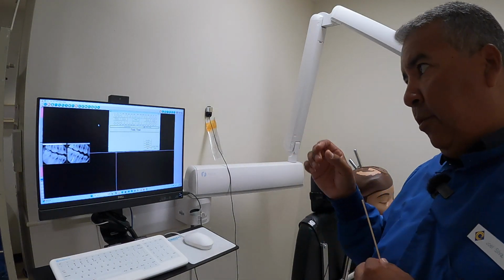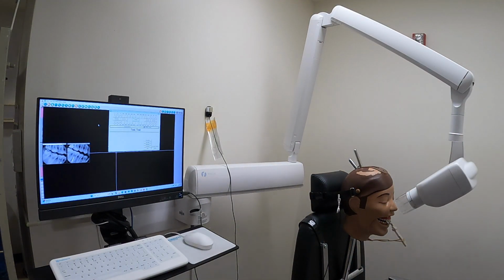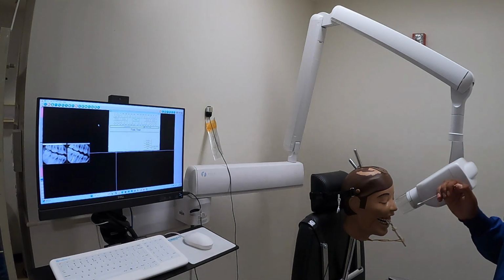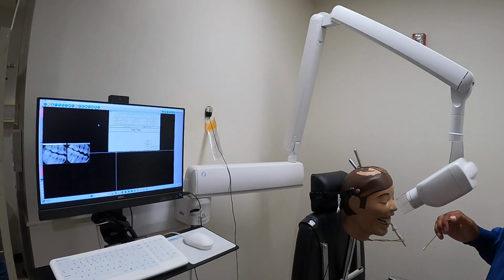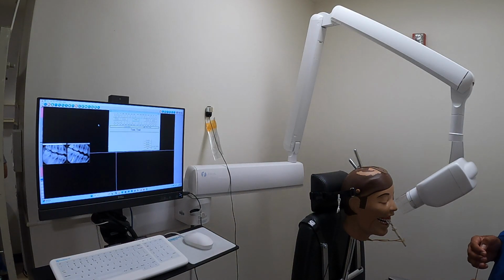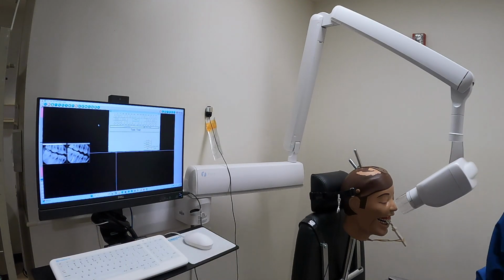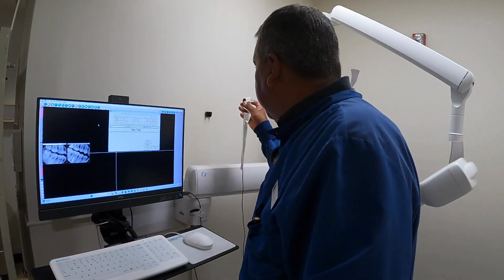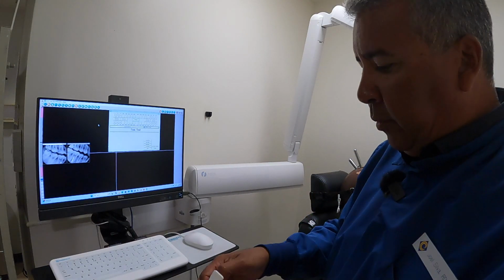If I took this right now, you would have a fairly accurate tooth. It wouldn't be long, it wouldn't be short. It would be pretty good when it comes to film. It's different when it comes to digital. I don't know what it is, and I don't even know how many different digital platforms out there are like this, but I know for sure that this one is.